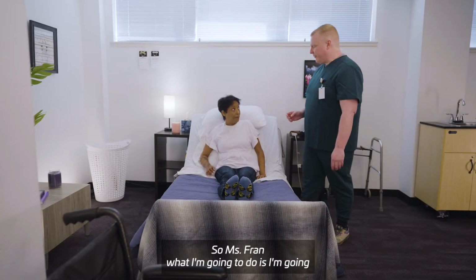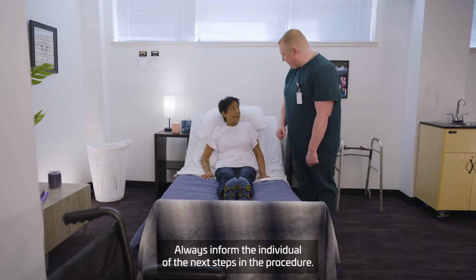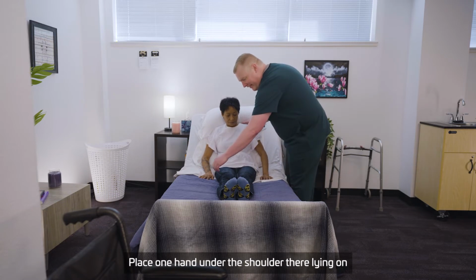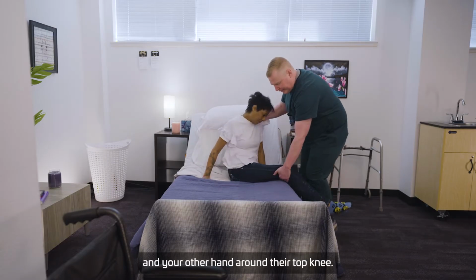So, Ms. Fran, what I'm going to do is I'm going to put one hand on your shoulder, one hand on your knees. On the count of 3, we're going to pivot. Always inform the individual of the next steps in the procedure. Place one hand under the shoulder they're lying on and your other hand around their top knee.